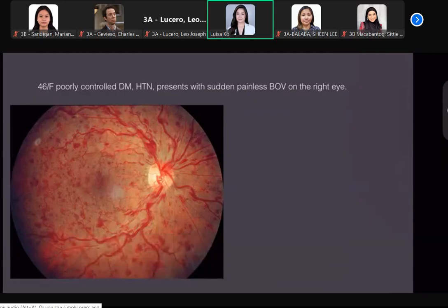There's a block in the drainage, so there's congestion. Because there's congestion, there's an increase in the pressure. Ideally, it cannot come back, so there's a higher pressure in your venous system. That's why it's congested. So your veins will look engorged. They look tortuous, they look bigger. That is why I said that the AV ratio is much bigger in this case, like a 4.